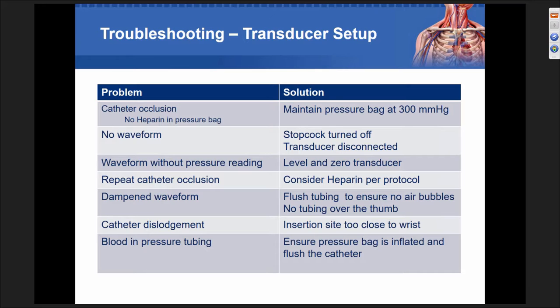Who's responsible for doing that? And how often is that being checked? And if you work beyond the pediatric world and you work in the adult world, and you have removed heparin from your bags, and you have patients that have a high thrombotic occlusion rate or a high platelet count, it would be interesting to see if you can move them by not doing everybody's saline, but also by adding heparin back into those high-risk patients. And that's really how we should use heparin as a strategy.